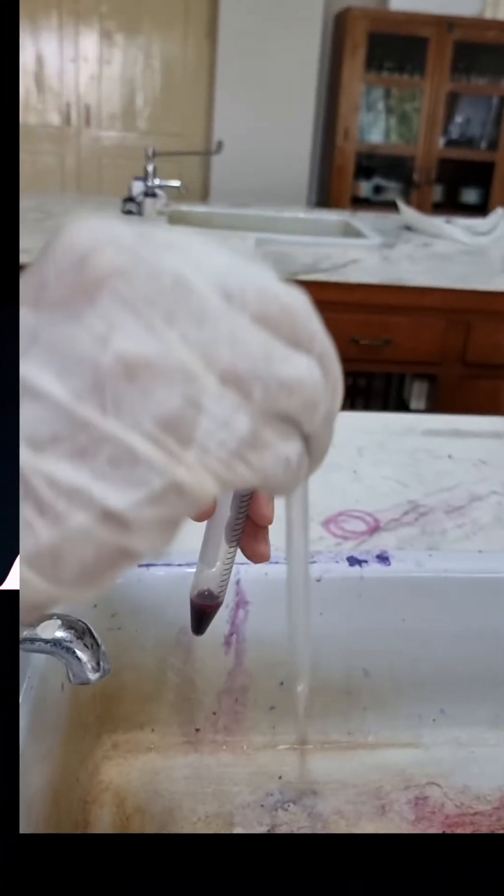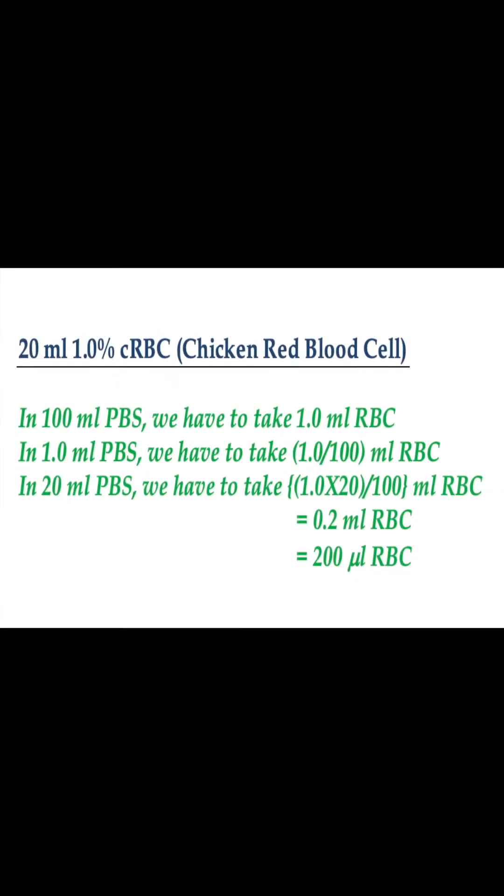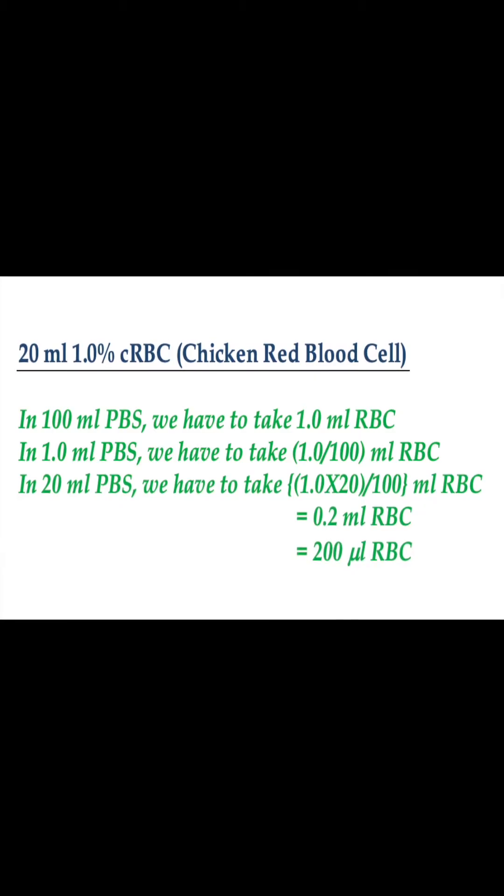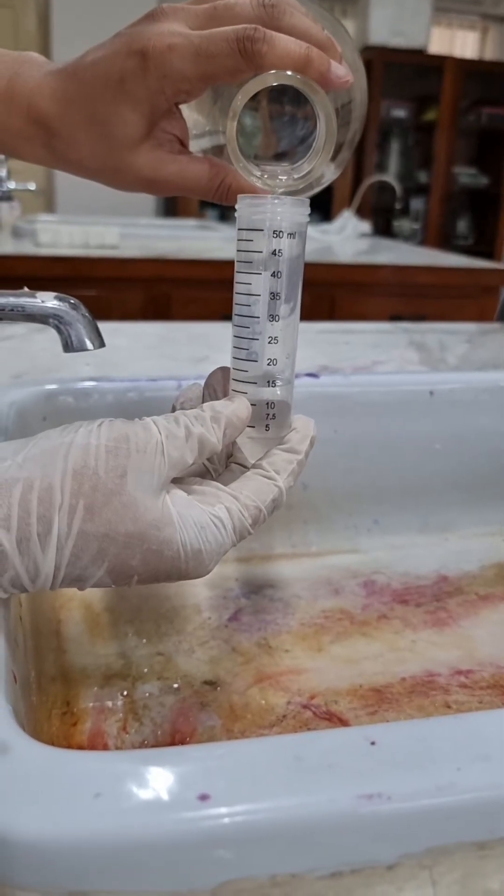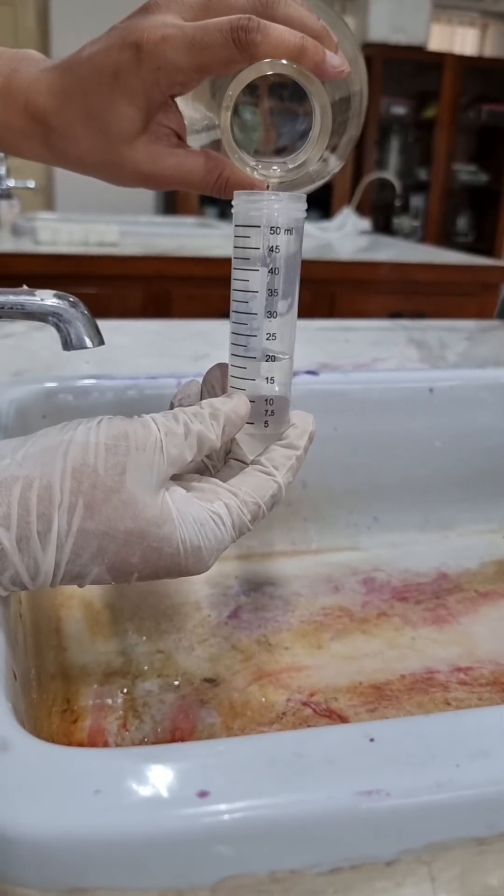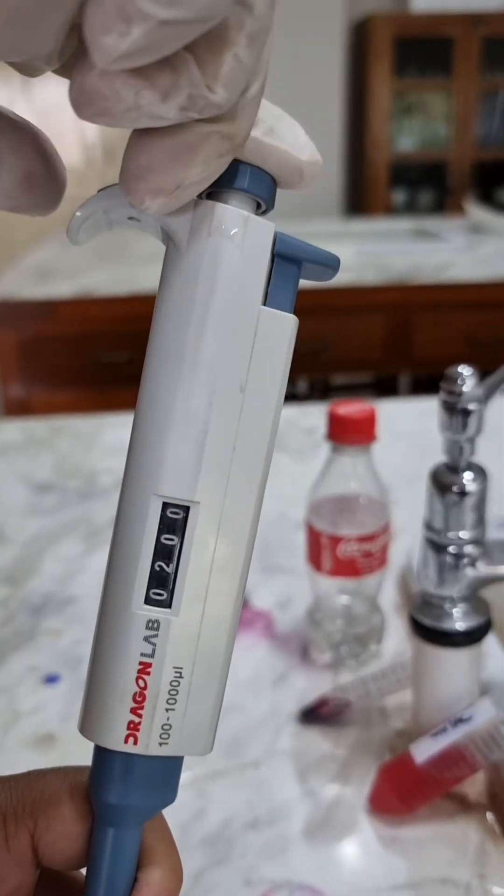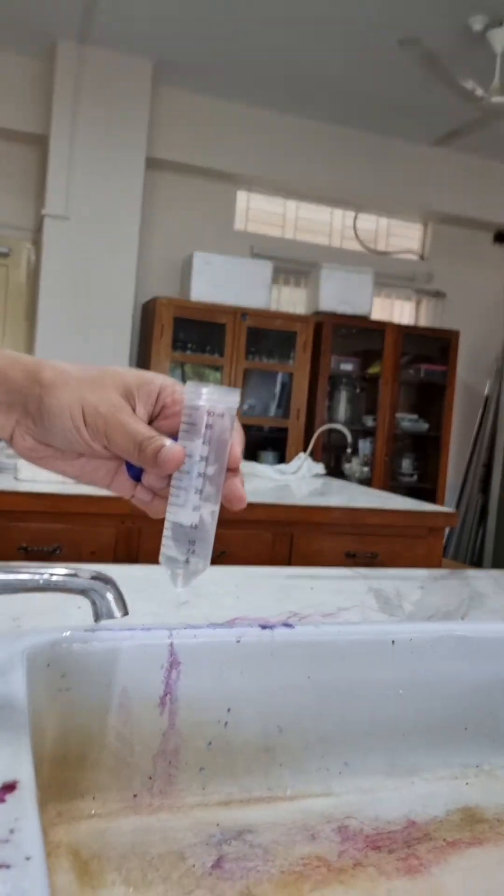Finally, this is the washed RBC that we are looking for. To make 20 ml one percent chicken RBC, we have to take 19.8 ml PBS and 0.2 ml RBC. To make things easier, we are taking 20 ml PBS from which we will discard 200 microliters of PBS to make room for 200 microliters of RBC.